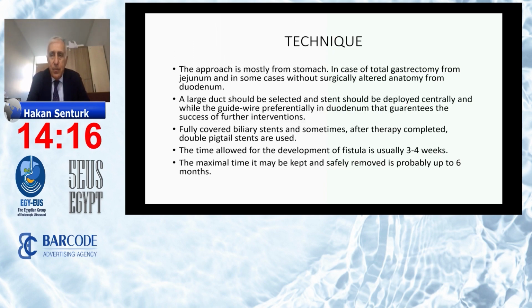The technique of endosonographically guided biliary approach is somehow different from what is in malignant conditions. The approach is mostly from stomach. In case of total gastrectomy, we approach from jejunum. And in some cases, without surgically altered anatomy, we approach from duodenum.